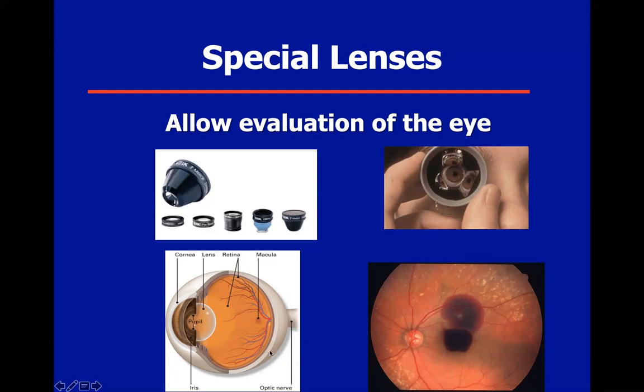understand the posterior pole. This shows, remember, previously I showed you the optic disc, the optic cup, and the vessels. Unfortunately, smack in the macula is a hemorrhage. So I will tell you this patient is practically totally blind because the hemorrhage, unfortunately, is covering the macula.